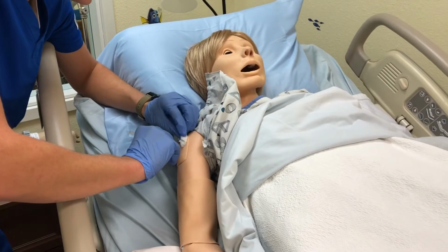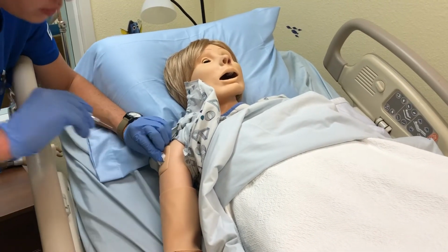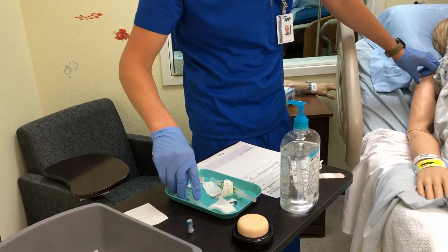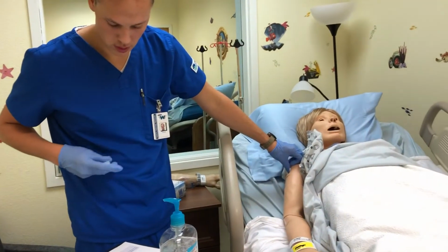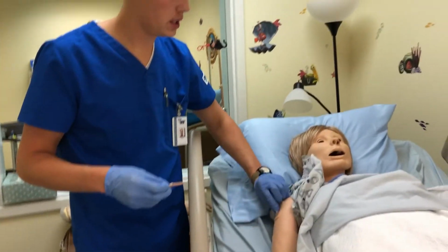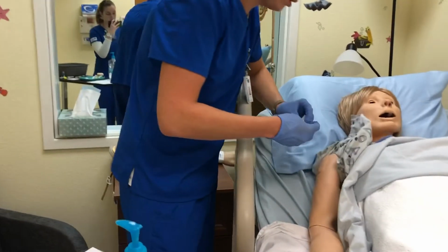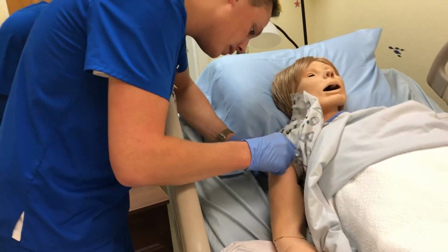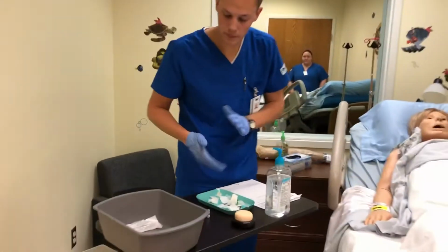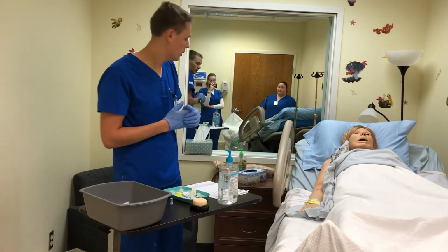And then when I retract it, I'll cover it with the gauze and massage it. So there's that. I'll start massaging and safety cap this. Massage. And then we'll get this Band-Aid ready. That Band-Aid on you. Perfect. Okay. And then I'll put those back on my tray and I'll be taking them out with me.